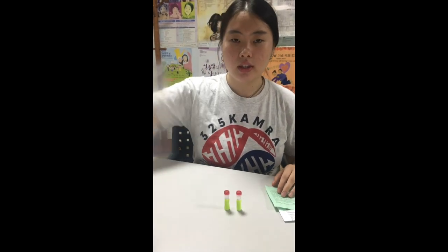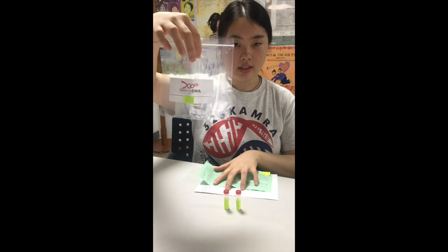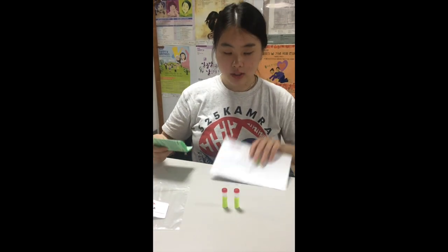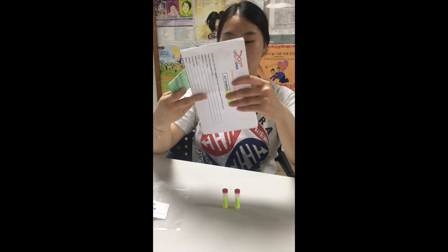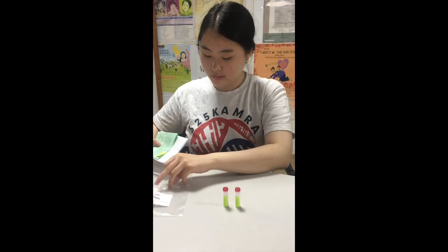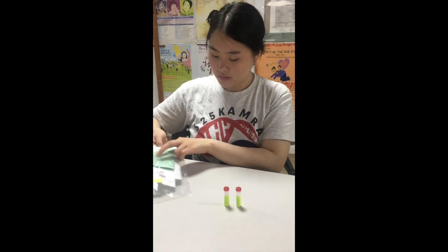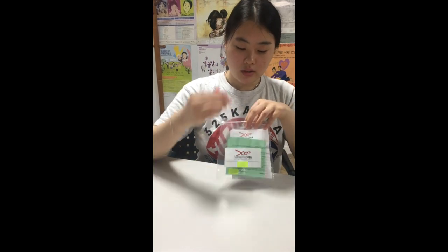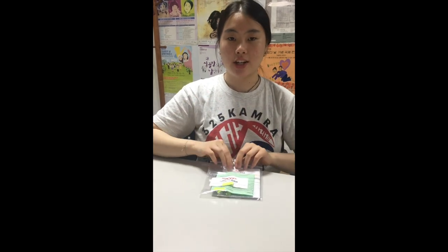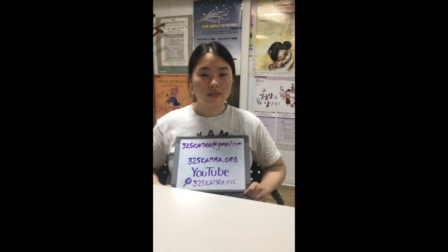After you're done with everything, you want to put all three of these in this plastic bag. If need be, you can fold this accordingly, like so. After you put everything in and close the bag, you're done — now all you have to do is wait.